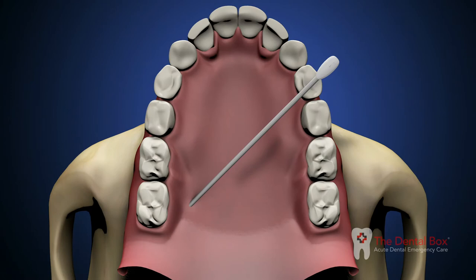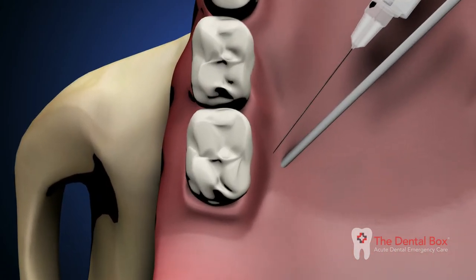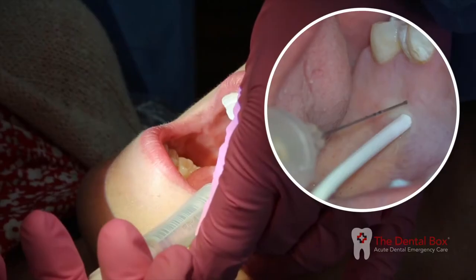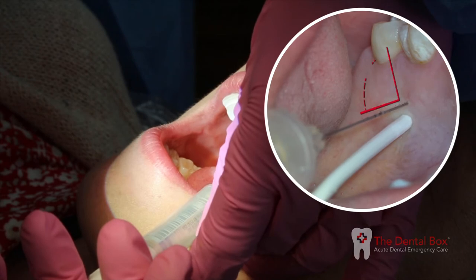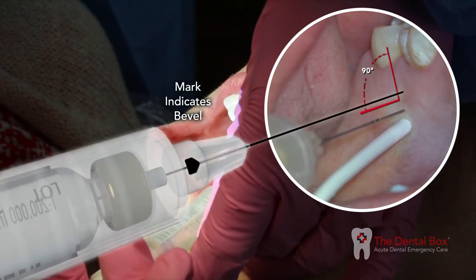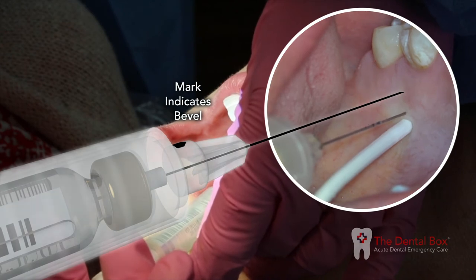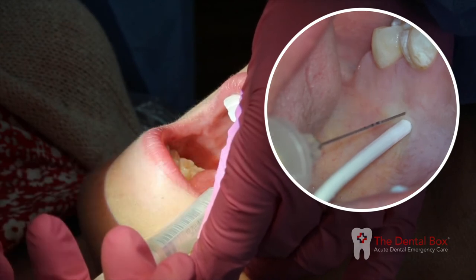You will note the blanching of the soft tissue with the pressure applied by the cotton swab. Direct the syringe into the mouth from the opposite side with the needle approaching the injection site at a right angle. Then place the bevel of the needle against the previously blanched soft tissue at the injection site.